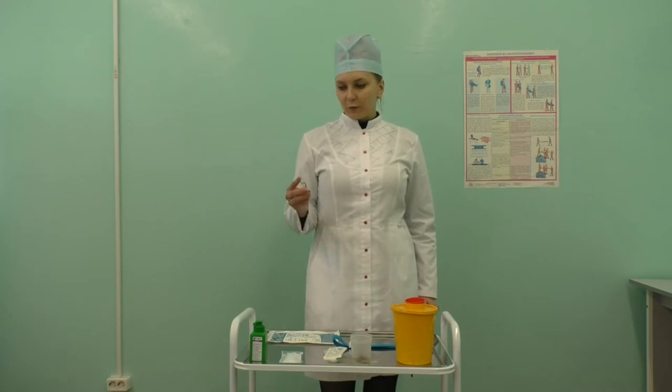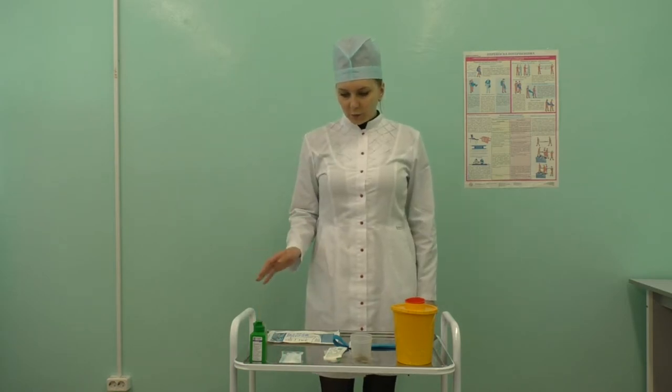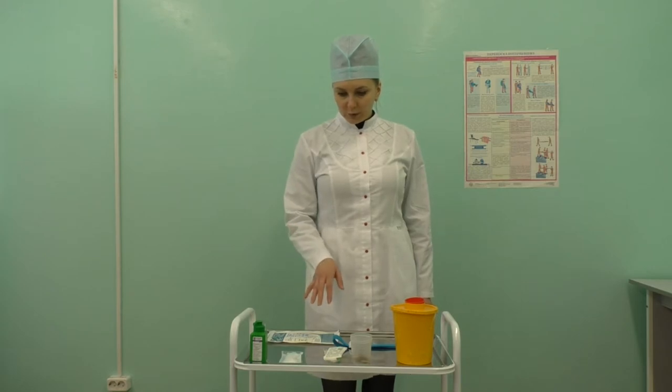Clarify any inconsistencies and check sterile equipment, including dates of exposure and sterility. Perform hand hygiene and apply PPE.